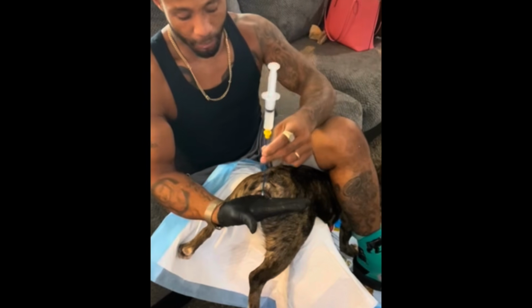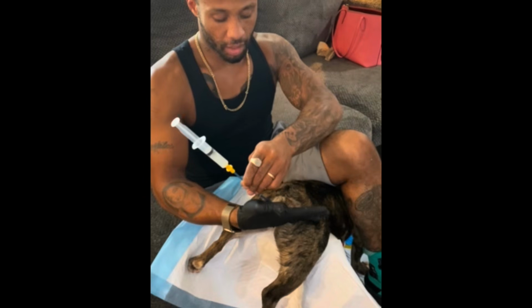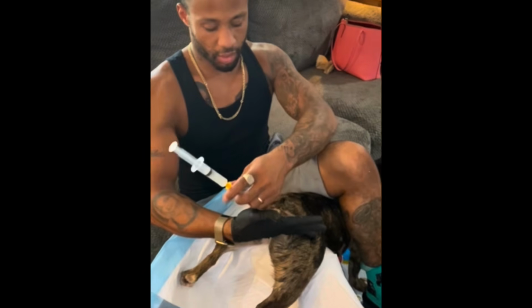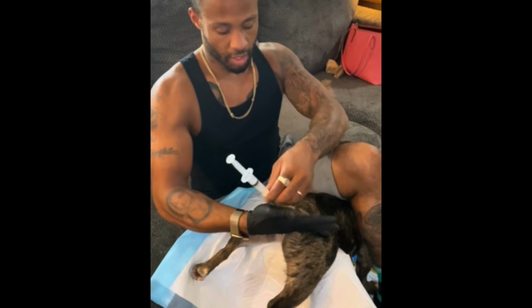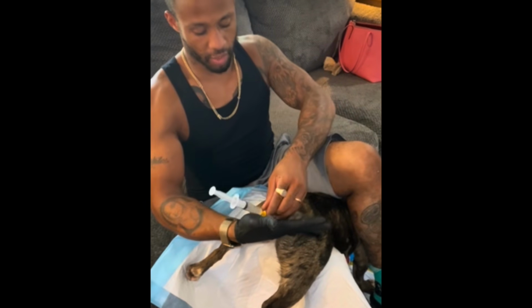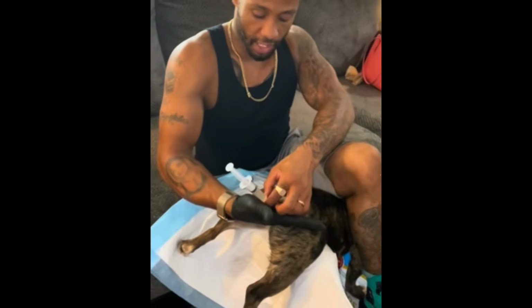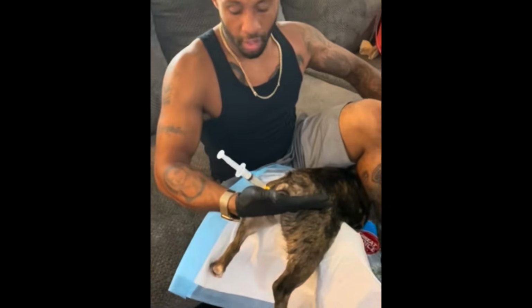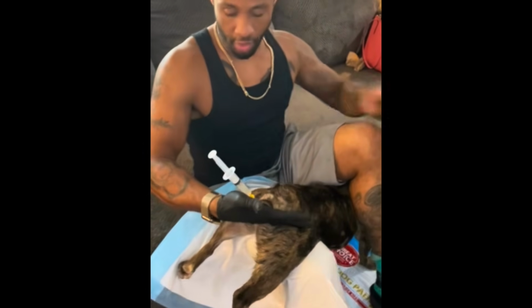What I'll do is I'll put this on the tip of my pinky finger and guide it in using my pinky finger as the route. And red. If you can see how much is actually in there, that's pretty good. It could go a little further if you can, but a small dog like her might not be able to. Don't want to hurt the dog. The 8-inch rod. This is pretty good, huh? Yeah, this is an 8-inch rod, if I didn't say so earlier.